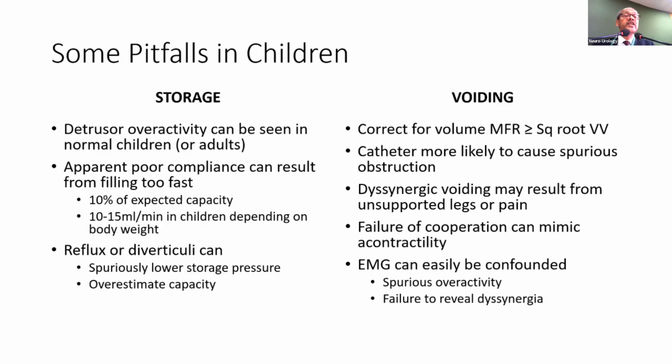So there are limitations to use of the EMG, and in our practice, except for the flow EMG, which still remains an important component of our evaluation in children, we do not really rely much on the EMG for the rest of the pressure flow study.